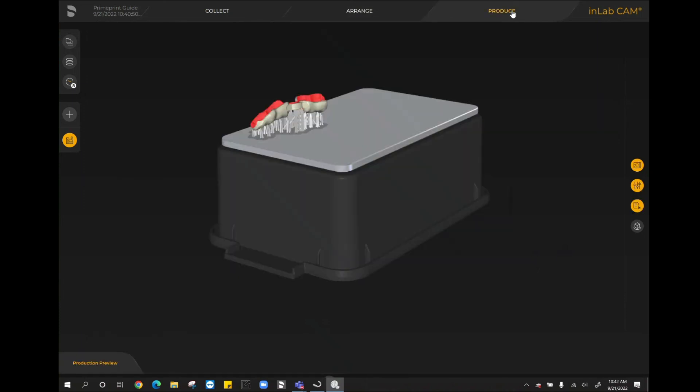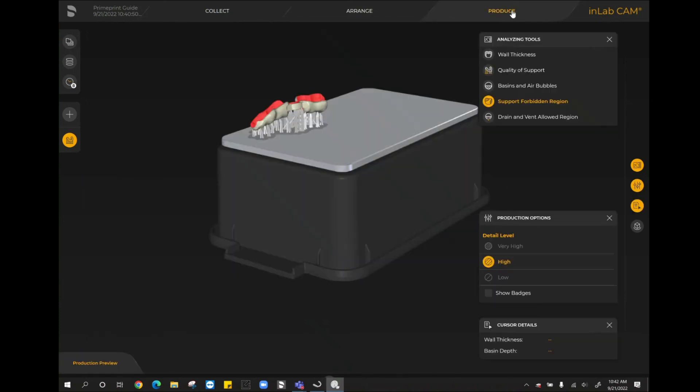So that has been the workflow for printing, or getting a surgical guide ready for printing, in InLab 22. Thank you so much and stay tuned for more videos.